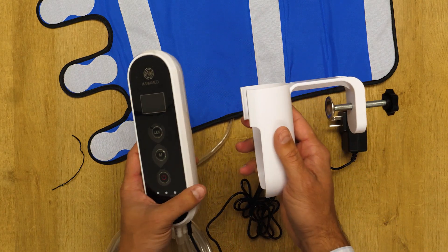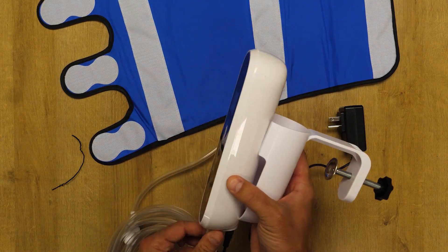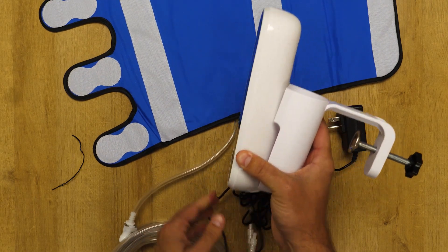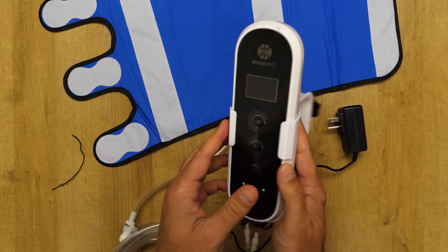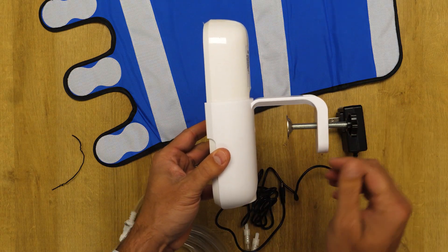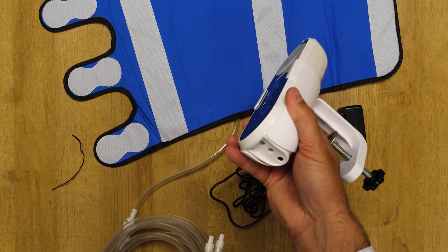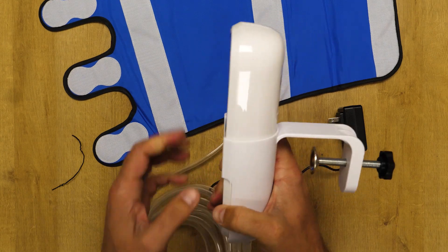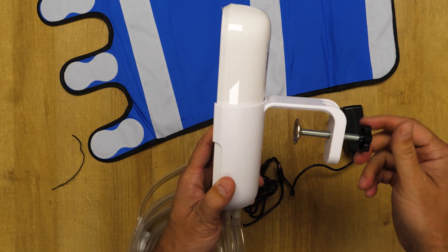To mount the product to the bed rack, you would go ahead and remove all tubing to make the device stationary. Insert it into the bed rack like this and then clamp it towards the end of the bed. Once clamped, the product can be used and you would insert the tubing to the bottom of the device — now we are secured onto the patient's bed.